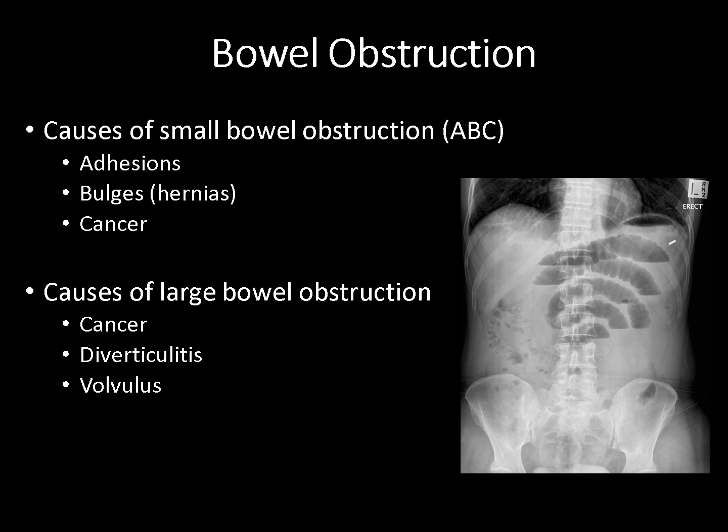And then there's also this more special entity in large bowel obstructions called a volvulus. And if you don't know what that is, it's when the large bowel twists on its own mesentery, and that twisting actually constricts off the bowel at two different points, causing a special case of a closed loop obstruction. And we'll get into a little bit more of what a volvulus is in the later slides.